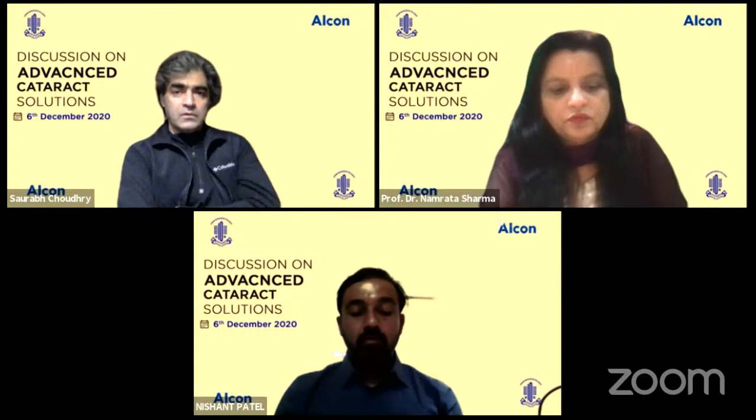we didn't have the option of toric multifocal IOLs. In such situations, our threshold was up to 0.5 in bifocals and earlier generation multifocals. But with EDOF and trifocal multifocal IOLs, we can stretch up to 0.5 to 0.75. Beyond 0.75, now that we have toric multifocals available, we'll go ahead with the toric multifocals if the astigmatism is more than 0.75.